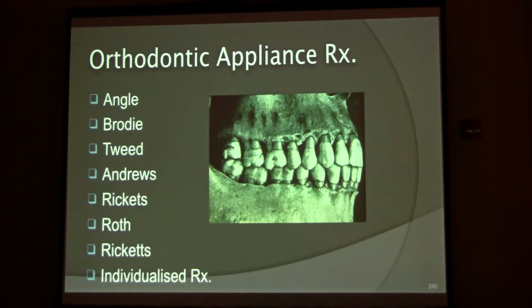Brodie and Tweed, Andrews came up with these straight wire appliances. Dr. Ricketts, Dr. Gino, and Roth added to it. And as Carl talked about, they moved towards a more individualized prescription. Over the years we've been able to get a little closer to what we want.